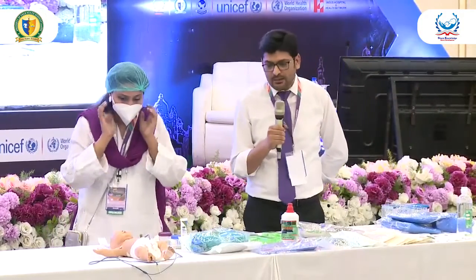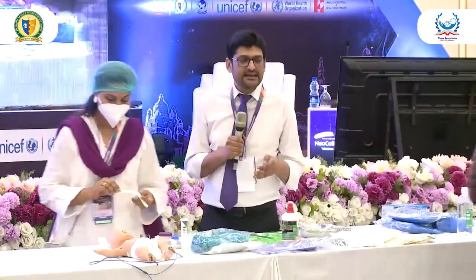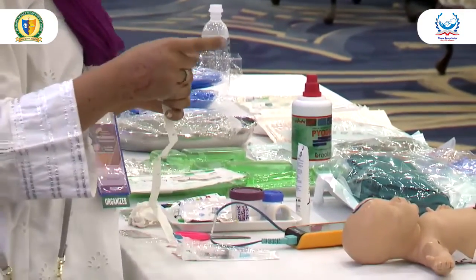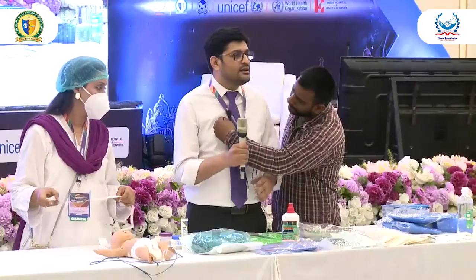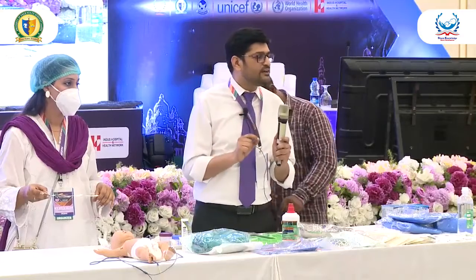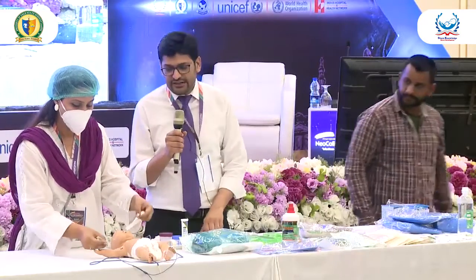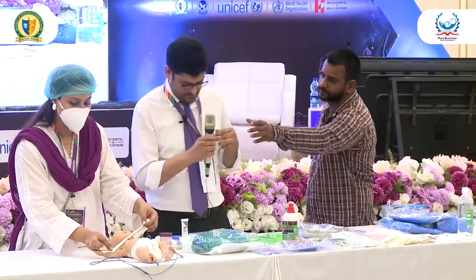Now, we are about to measure the desired length of insertion from the site of prick to the depth of insertion. That is, as Professor Irfan Waheed has mentioned already, the junction of the superior vena cava or inferior vena cava with the right atrium. Our sister is going to demonstrate. We are going to use the basilic vein.